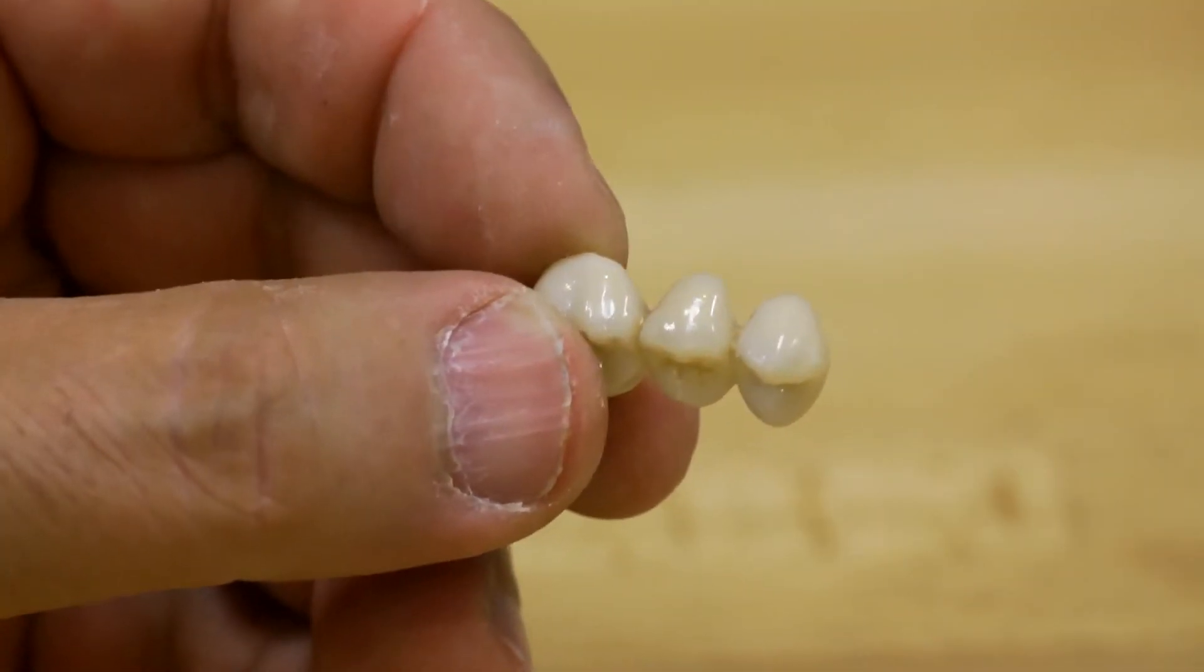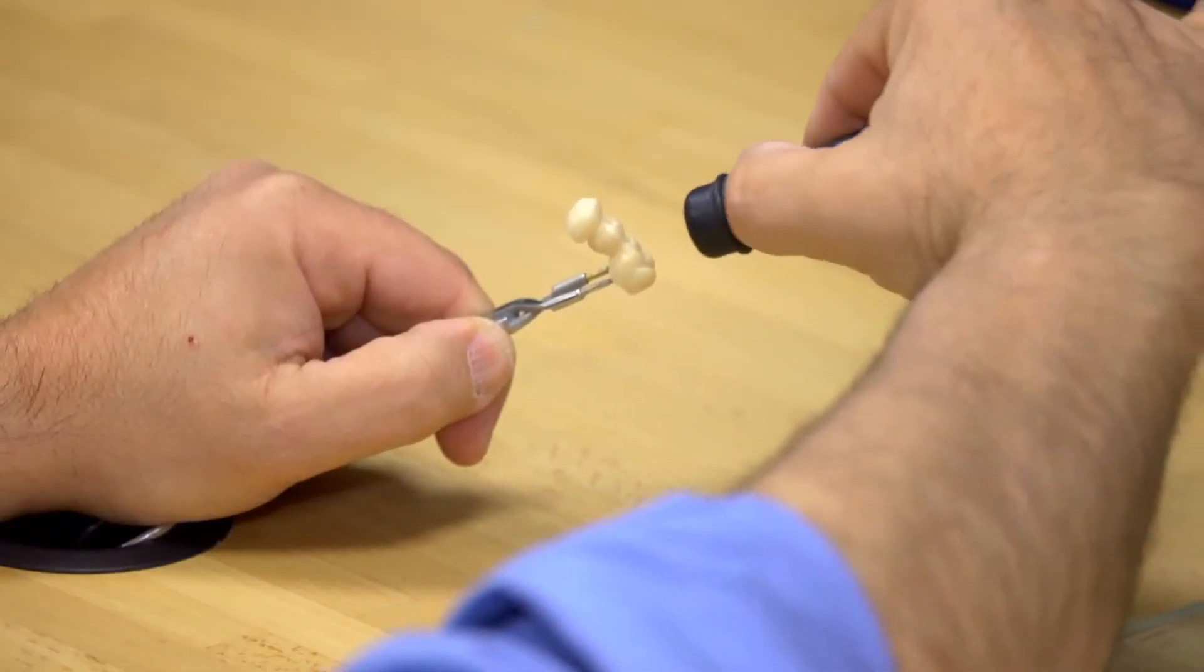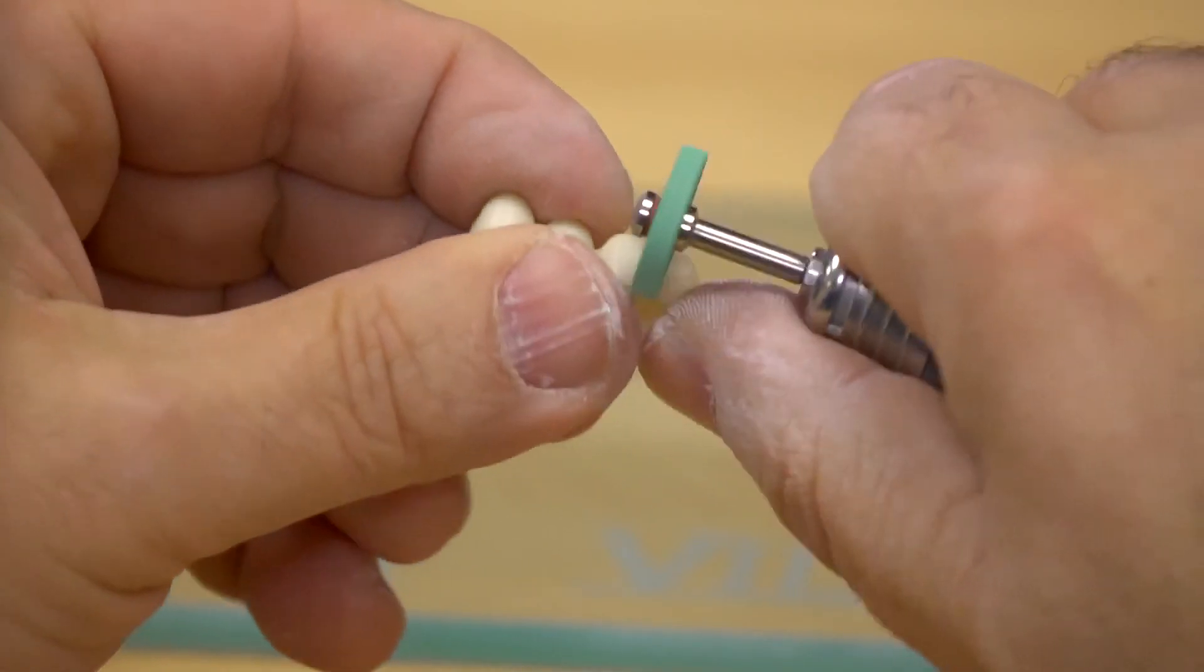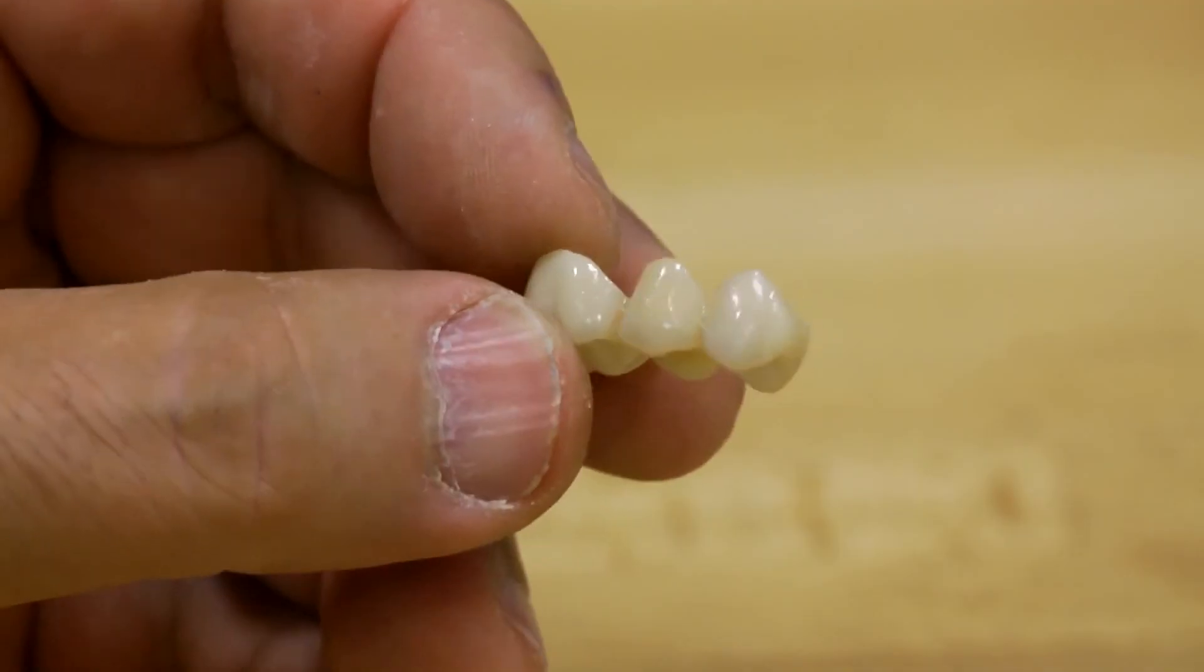The final restoration will exhibit a high gloss finish. Congratulations! You have now completed all necessary steps to design, mill, and finish an Inchorus TZI restoration using your Sirona InLab system.